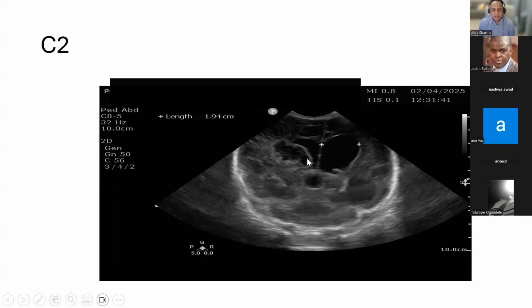So it's a parenchymal infarct, and it's a venous infarct. It's basically a grade 4 IVH. It's not a very nice image for the baby, but it's a very nice image which basically shows both your lateral ventricles. And this ventricle has what appears to be a large hemorrhage inside the ventricle. But just remember that this hemorrhage doesn't originate inside the ventricle, it's because of venous congestion.